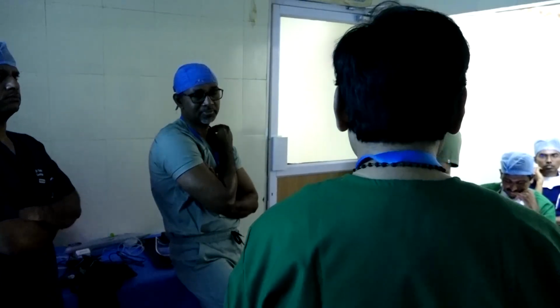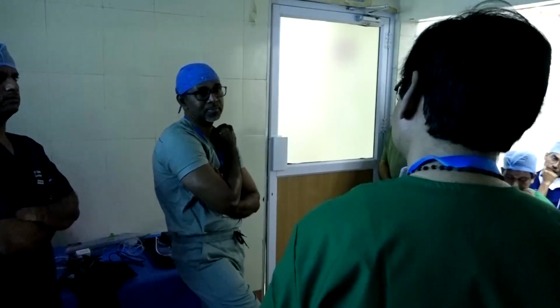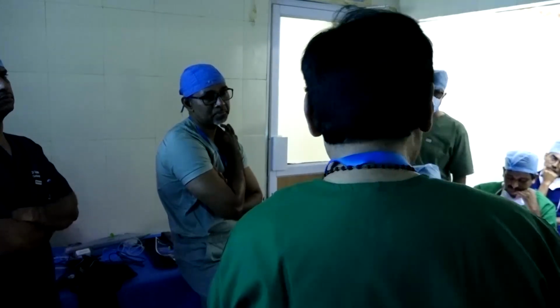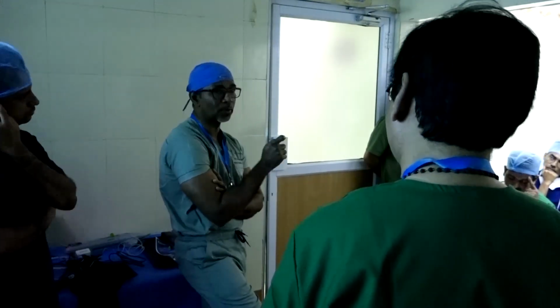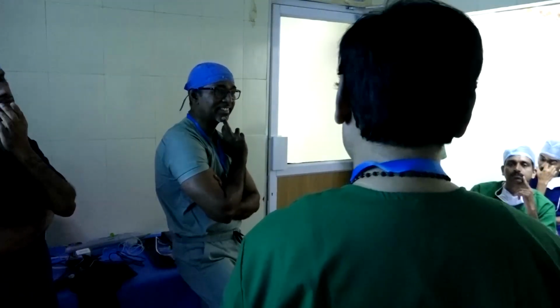As the resistance increases, the long jump will be more and more with rota. That is the main drawback. In calcified lesions, once it gives way it is sudden, with no control, not under our control.